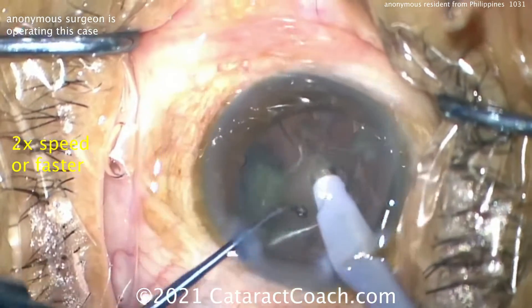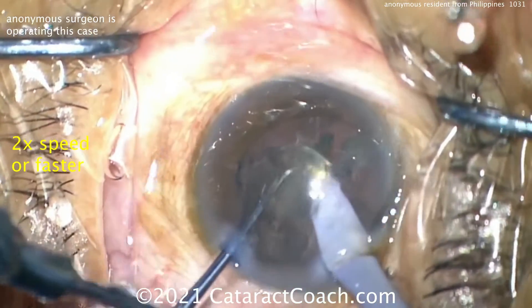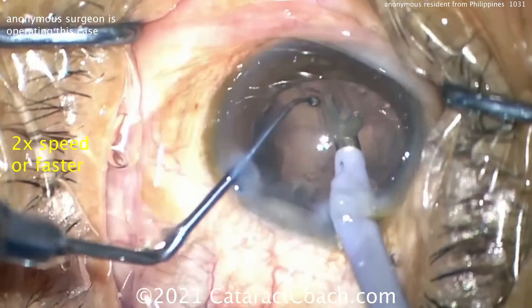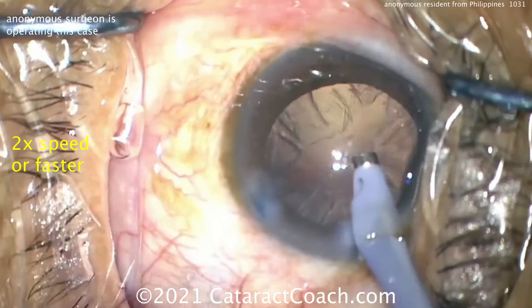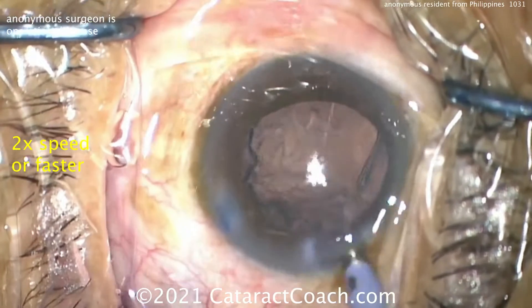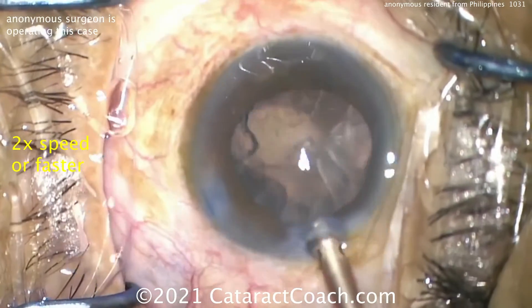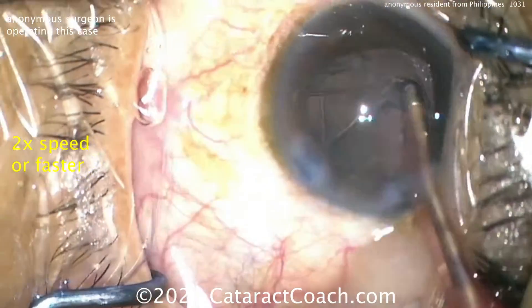Here comes the last bit of nucleus coming down the probe quite nicely — very efficient, very good. We've sped this video up and it's been edited to show pertinent points. Taking down that last piece — I like the chopper in the safety position. That chopper, though, is not my favorite because it has that big bulbous olive tip on the end. It's like giving me a butter knife and asking me to cut something — it won't work that well. You want to upgrade to a chopper without that bulbous tip. It gives a false sense of security about capsular bag safety, and it's simply less effective.